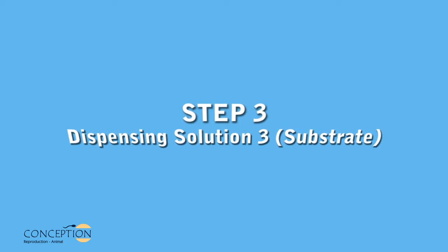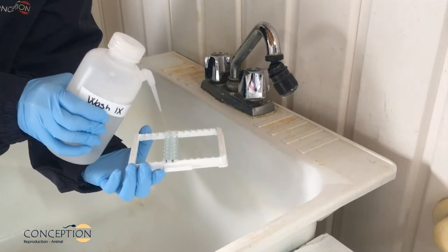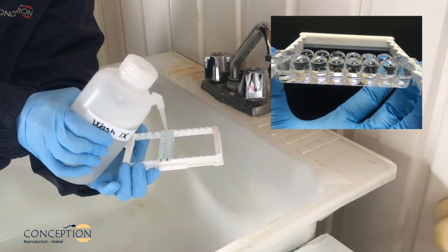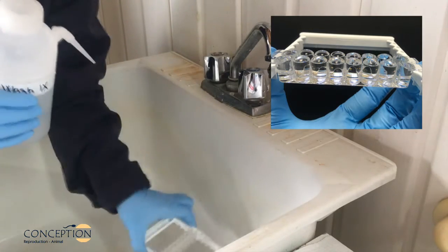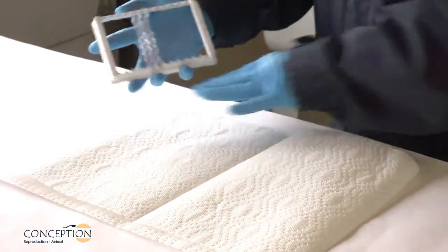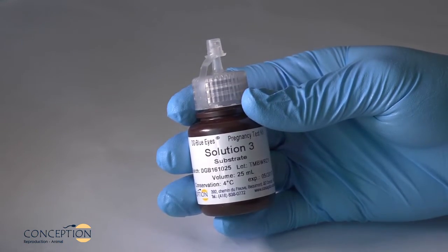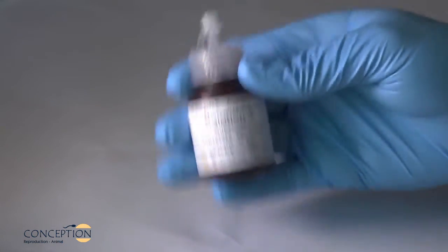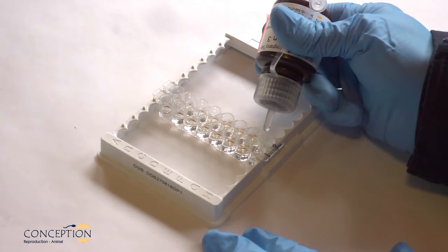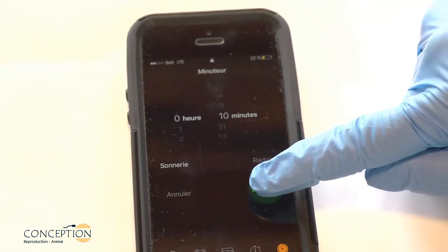Step 3: Dispensing Solution 3, substrate. Remove the plate cover and empty the plate by inverting and shaking vigorously in a sink. Repeat 5 times. After the fifth wash, invert the plate and tap vigorously on clean absorbent paper towel to remove residual liquid. Gently shake Solution 3, substrate, and dispense three drops into each well. Gently shake the plate to mix, cover the plate, and incubate 10 minutes.